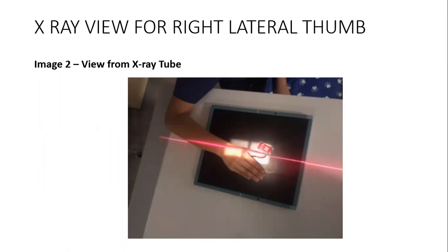I verified the source to image receptor distance that was precisely 40 inches. I verified this by the viewing screen on the central ray, as well as using the tape measure that's also located on the central ray.